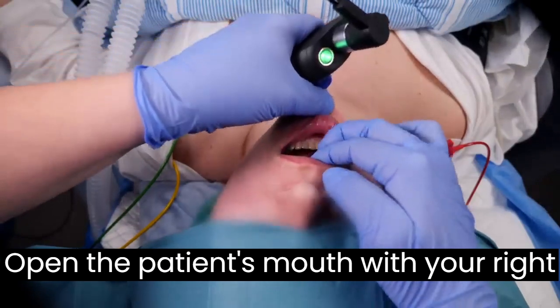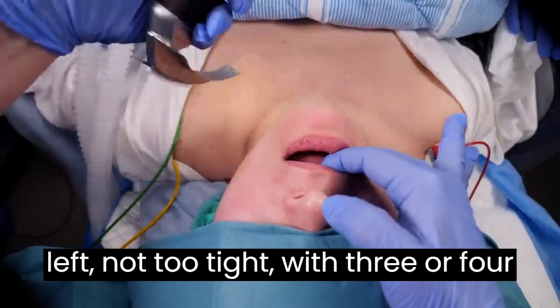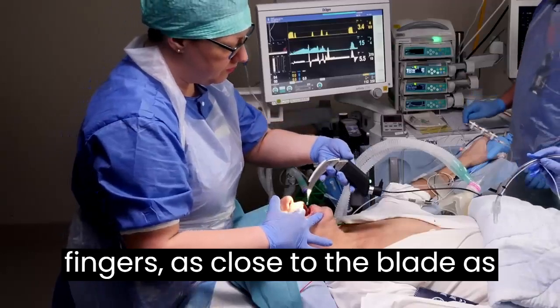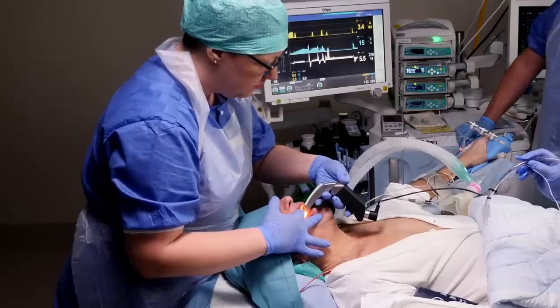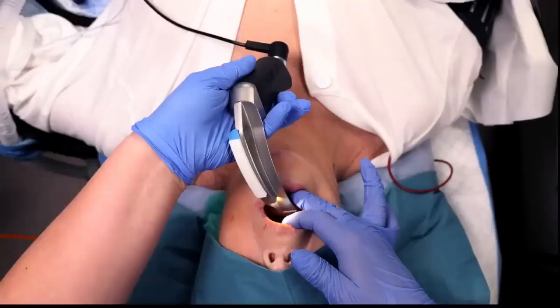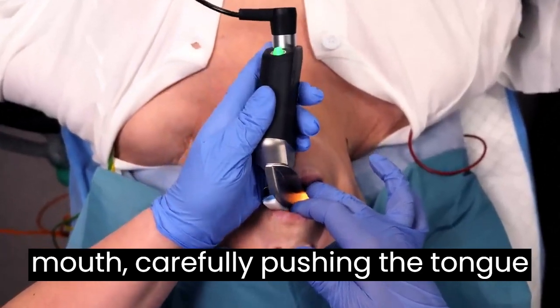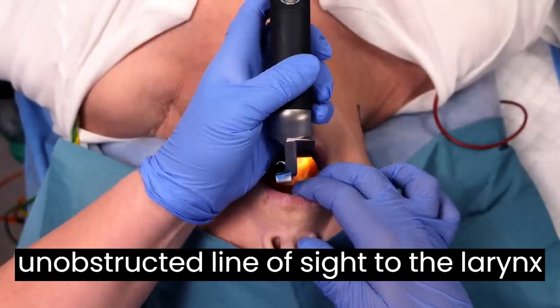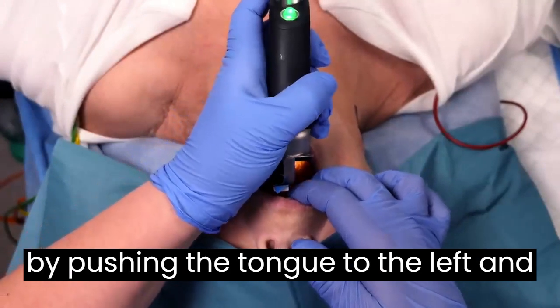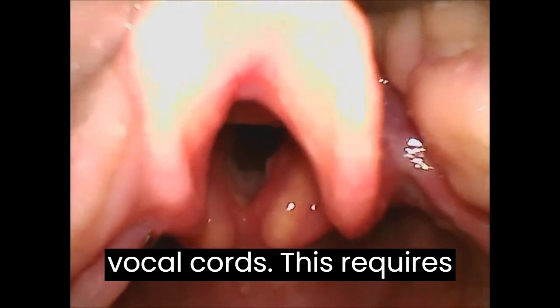Open the patient's mouth with your right hand and hold the laryngoscope in your left. Not too tight, with 3 or 4 fingers as close to the blade as possible for precision and control. Insert the blade in the right side of the mouth, carefully pushing the tongue aside. The aim is to create an unobstructed line of sight to the larynx by pushing the tongue to the left and lifting the epiglottis, exposing the vocal cords.